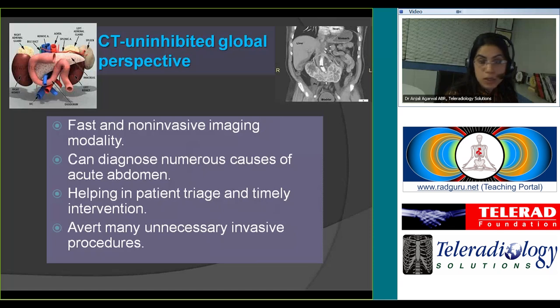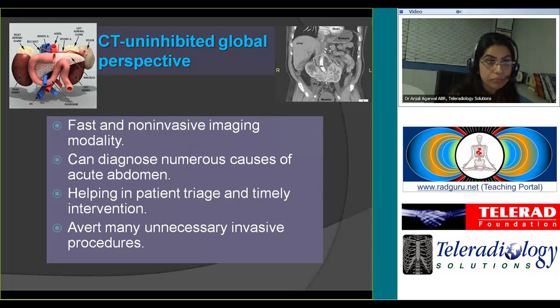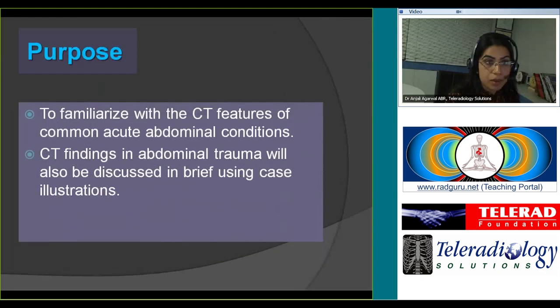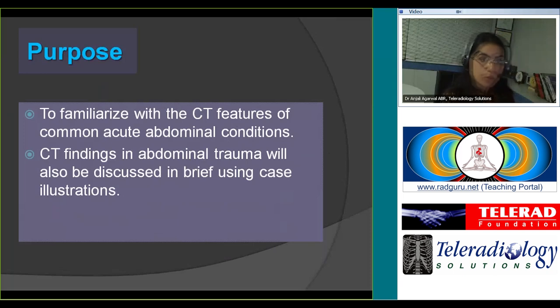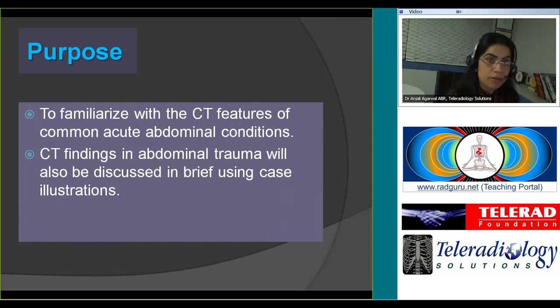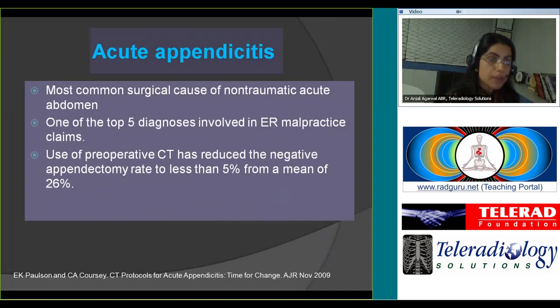You can also help avert many unnecessary invasive procedures and surgeries by giving the right diagnosis. This talk will cover the common acute abdominal conditions, and I will briefly discuss CT findings in abdominal trauma at the end. The most common surgical cause of non-traumatic acute abdomen is acute appendicitis.